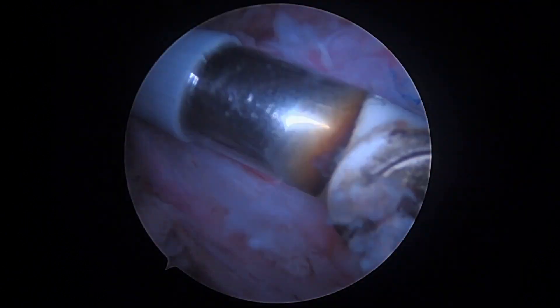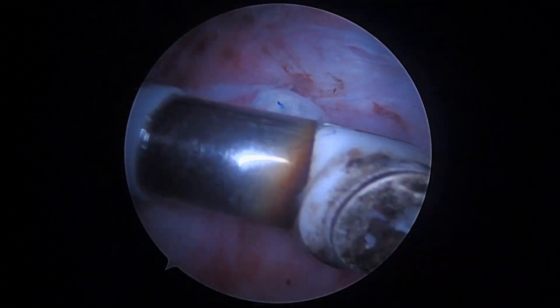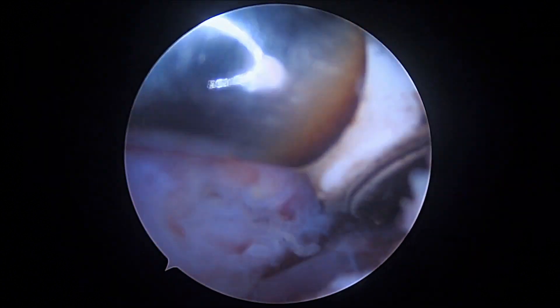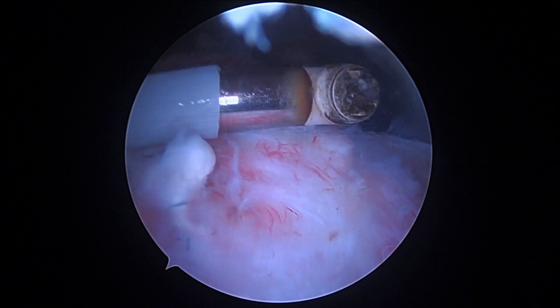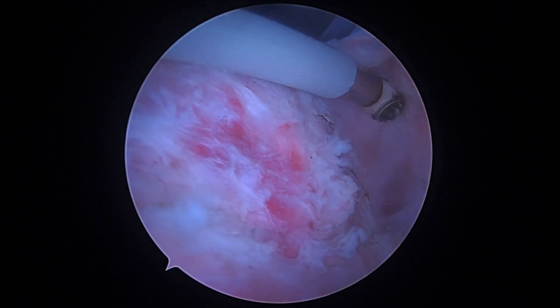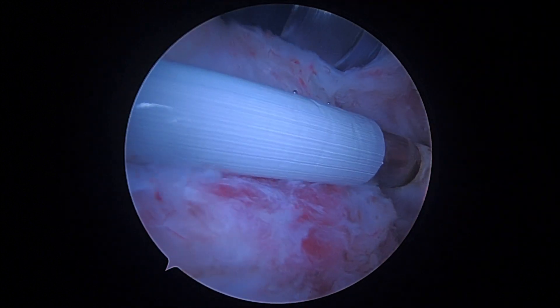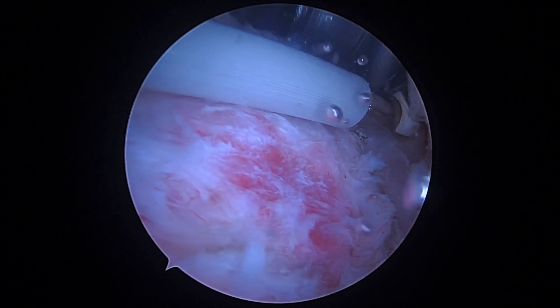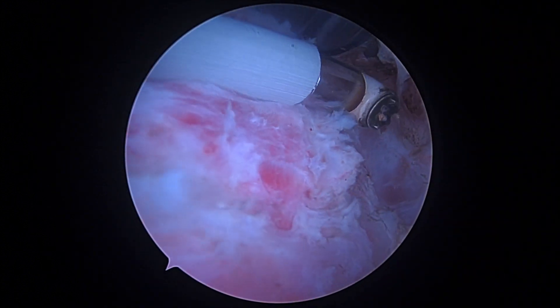So you know, when we did this before we put in a whole bunch of sutures — like seven or eight — and for the most part they've all been covered up like they're supposed to be, so that's a good sign. I don't see any gaps in the tendon, that's another good sign. You had a lot of inflammatory tissue. Here's a suture right here — see how they get covered up — there's one, there's another one, but they get hard to see. So I don't think we have to revise the repair. I think that held solid even though you had that little bit of an injury. That's the best of all possible news. We're going to finish up shortly and get you back to the recovery room. I really hope this does the trick for you, and like I said, I think this is good news. Good luck to you. Bye bye.